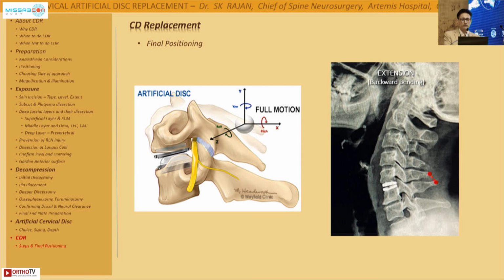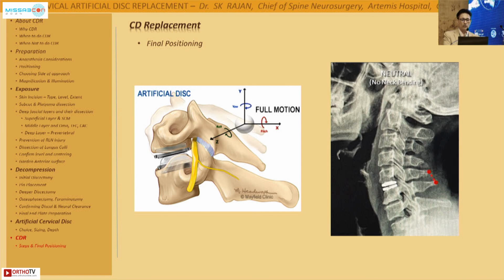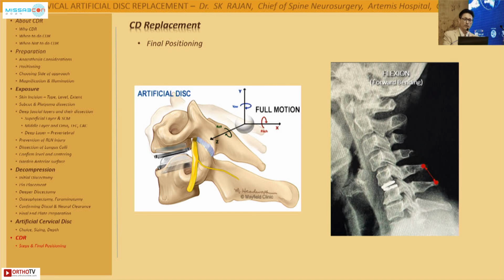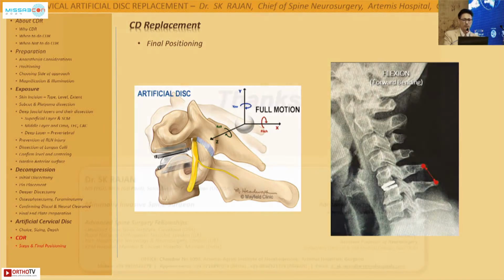And this is just one final slide. This is how the displacement should be, so that you are able to make sure that the movement continues even after a few weeks and months and years of the surgery.